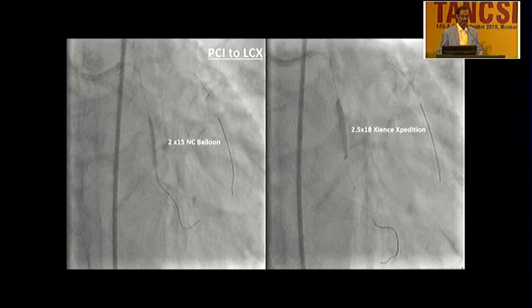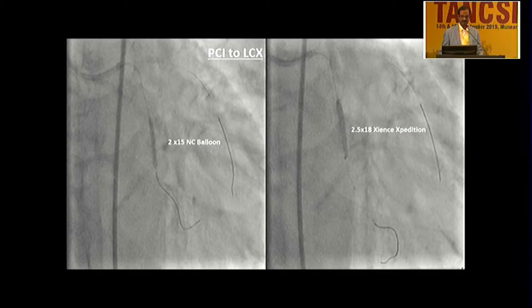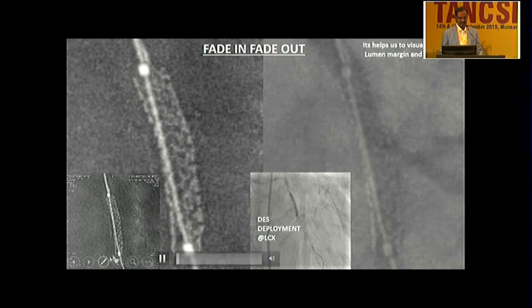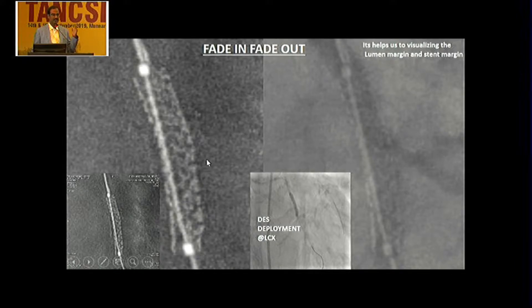The LAD and LCX were wired with BMW wires, and a 2 into 15 balloon was used first. The LCX lesion was prepared and a 2.5 into 18 mm Xpedition stent was deployed. The software is showing fade-in fade-out, in which we can see the stent apposition and vessel wall.